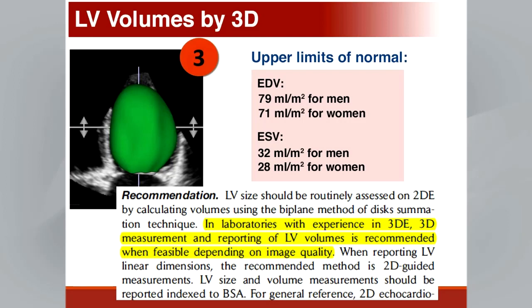You can see that these numbers are slightly larger, as we would expect, than the two-dimensional numbers, and slightly lower than the normal values of cardiac MRI. We recommend that in laboratories that have experience in 3D echo, 3D measurement and reporting of LV volumes is recommended when feasible, depending on image quality. Well, this is a good and a bad sentence, because the only way you can get experience is if you try to do that.